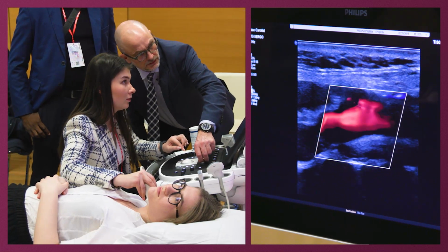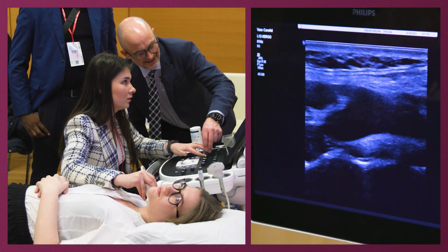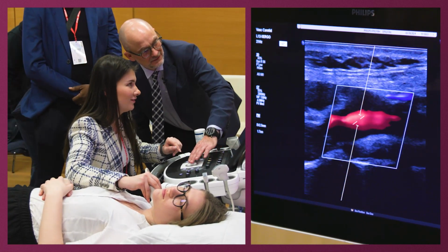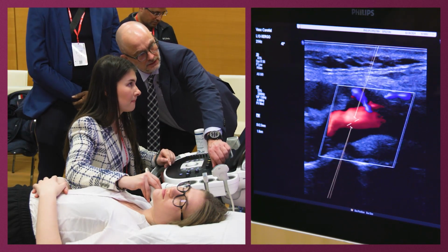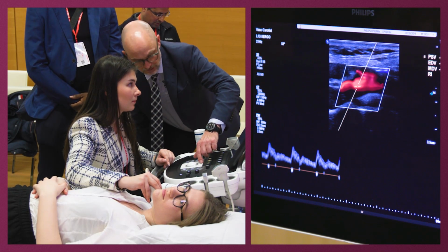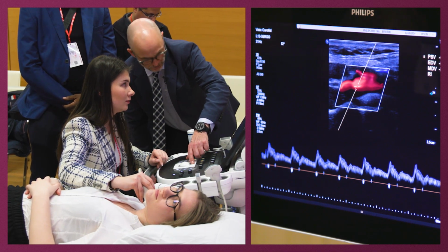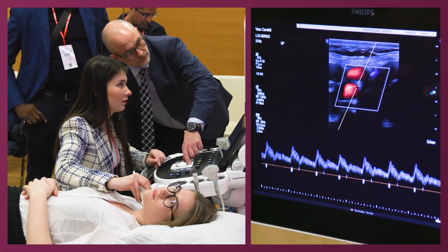I'll give you a little bit more gain. No, I'm sorry, let me, I can help you. Color. Yes. And then we should look at how this looks. Adjusting a little bit here. That's why we usually have this kind of auto inversion. You are right. This is probably the veins, and the internal will be after. Agree? Can you find the external without moving too much?